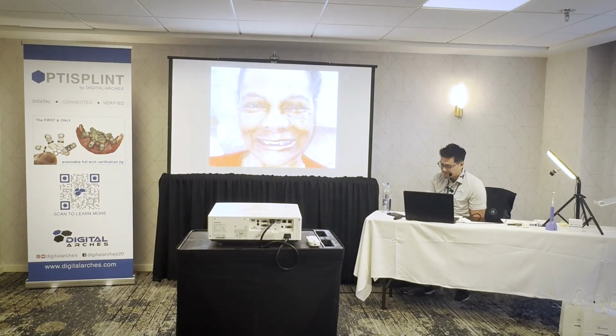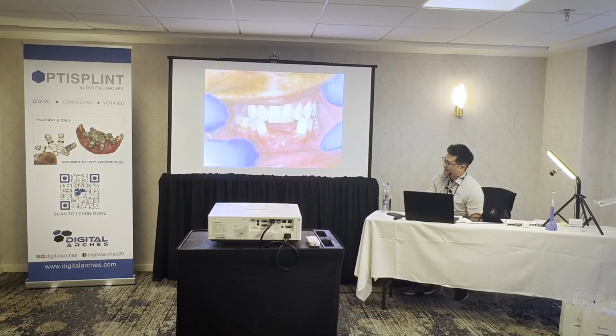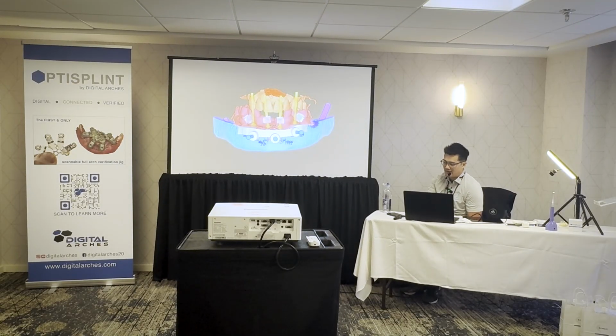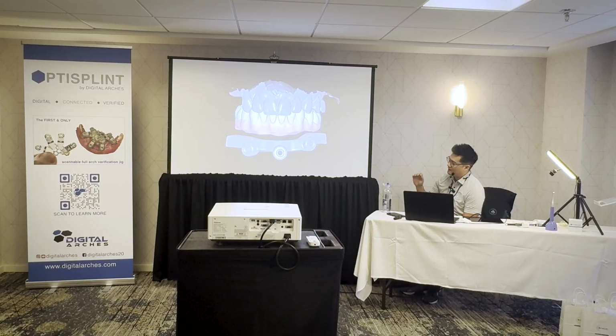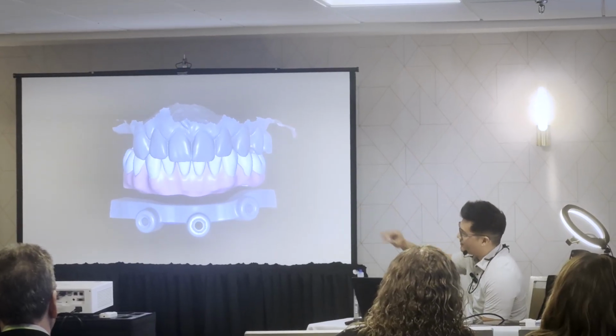Here's a case, Pamela. That's a lower arch case. And this is the case we did guided in co-diagnostics. And so we designed a bone reduction guide. And then this is our takeoff, what we call takeoff position. So for every single case that we're going to do this for, we have a wax up ready to go. We have our antagonist that's already in the same coordinate system.